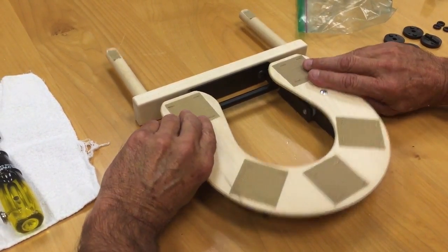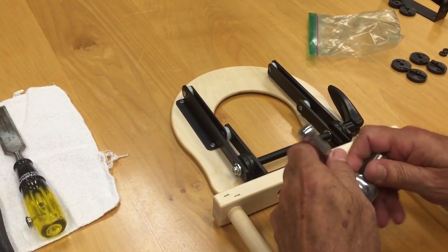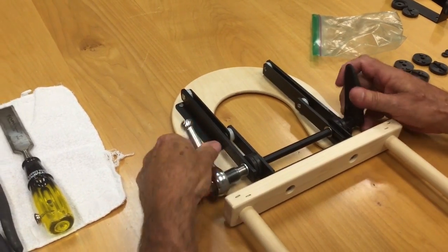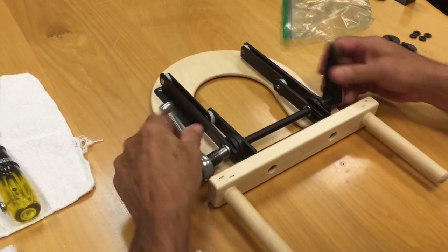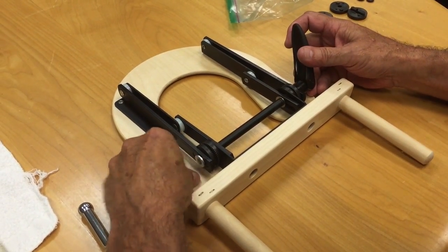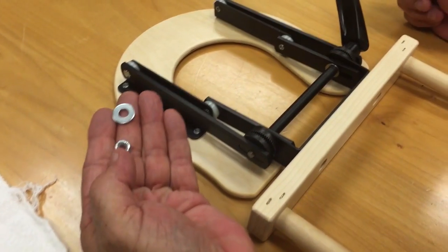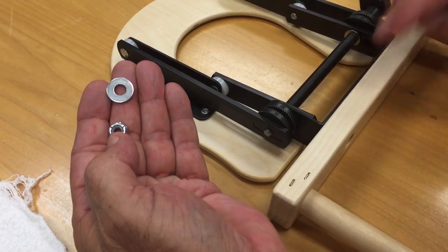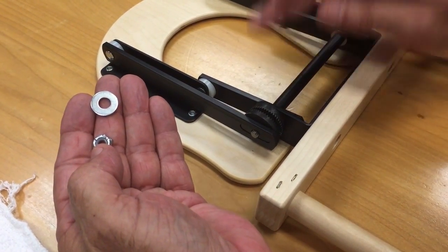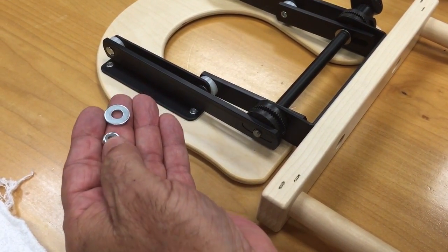Okay, so the first step in disassembling our FaceRest would be to loosen the nut on the end. This just takes a 7/16 socket or a wrench. This washer is different from the other 4 washers in that it's thicker, and these are an industrial 44 thousandths thick washer. This is a standard USS washer.